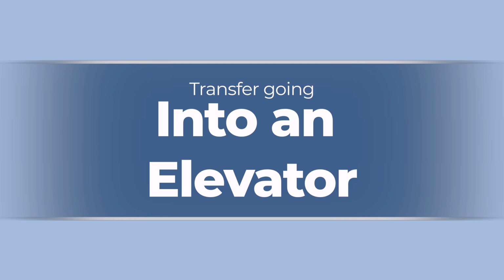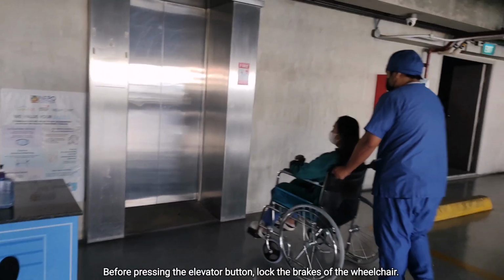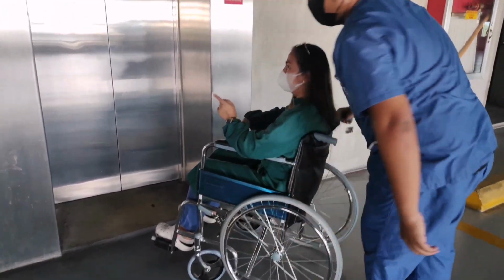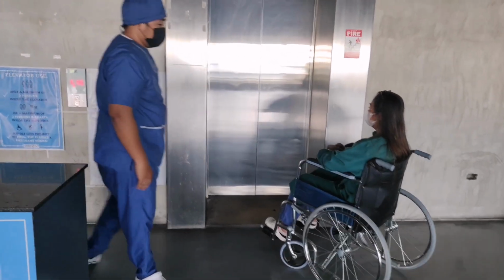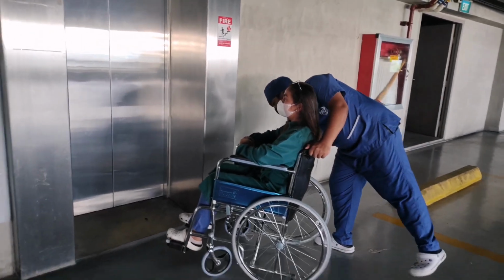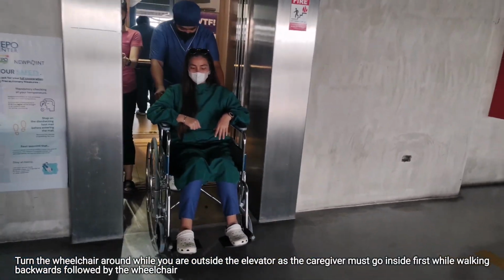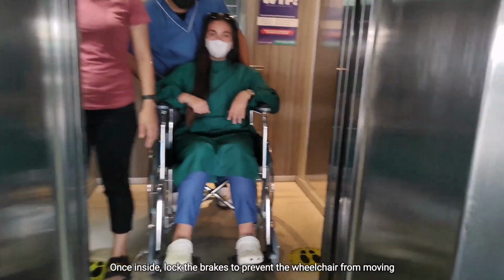Transfer going into an elevator. Before pressing the elevator button, lock the brakes of the wheelchair. You can unlock the brakes while waiting for the elevator door to open. Turn the wheelchair around while you are outside the elevator, as the caregiver must go inside first, while walking backwards, followed by the wheelchair. Once inside, lock the brakes to prevent the wheelchair from moving.